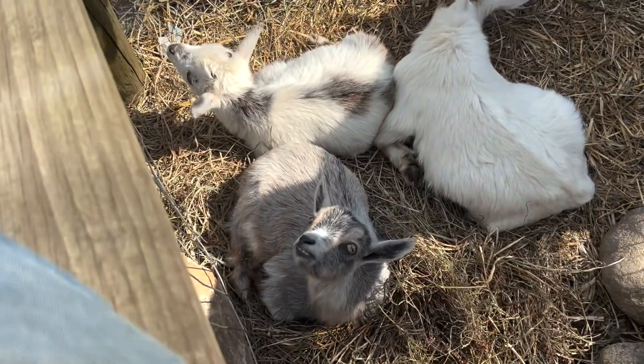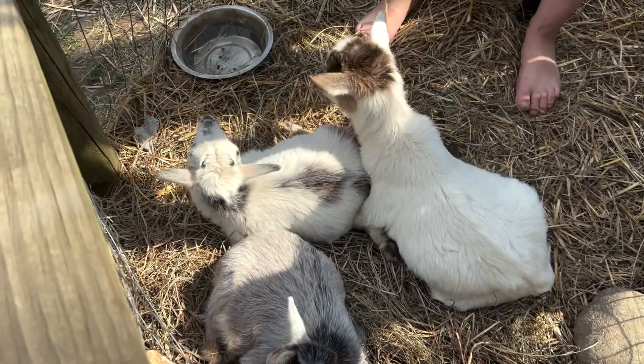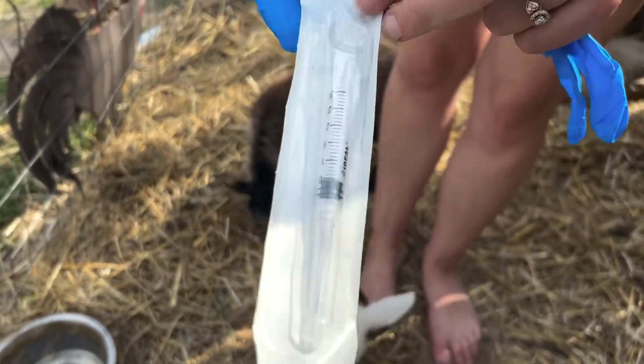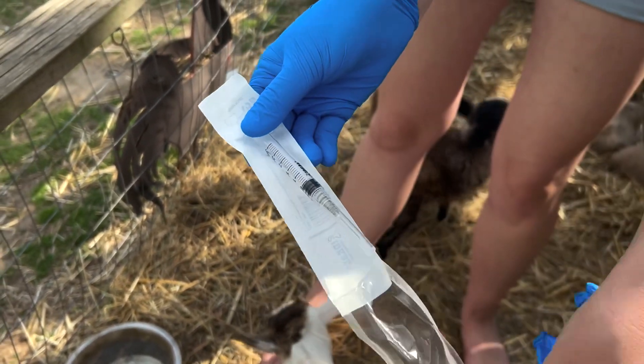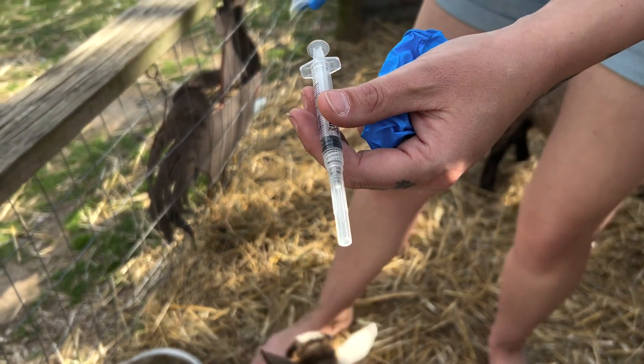You can get your syringes and needles at the farm store too. I'm going to use these ones that have a 22 gauge, which is the smallest gauge needle you can get, and it's just three-quarter inch long — I'm doing that with the babies. With the moms, I use the 20 gauge, and I don't really mind if it's three-quarter inch or one inch long.